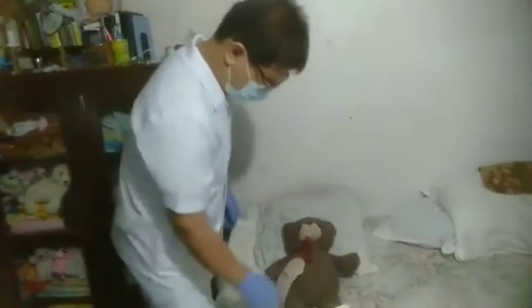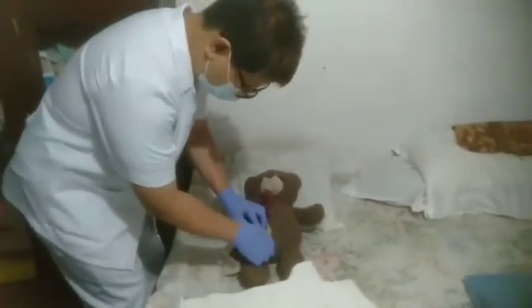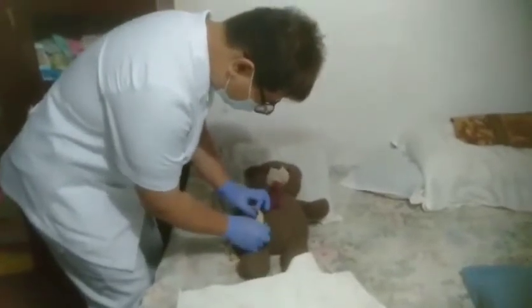Empty the contents of the pouch through the bottom opening into the bedpan. You put it on the bedpan after you have opened it. Okay. And then assess the consistency and the amount of effluent. Peel the bag off slowly while holding the client's skin taut.